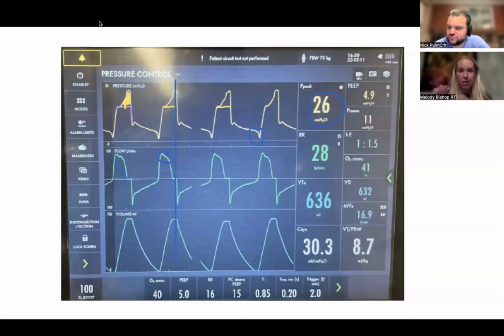So we plug numbers into the ventilator, and we have a specific trigger, a specific control, and a specific cycle, cycling down to whatever baseline. But then we have a patient on the other end, and if they are not fully sedated and not paralyzed, they have their own neurologic drive to breathe, and that is happening and occurring. As they become more sick, that worsens.